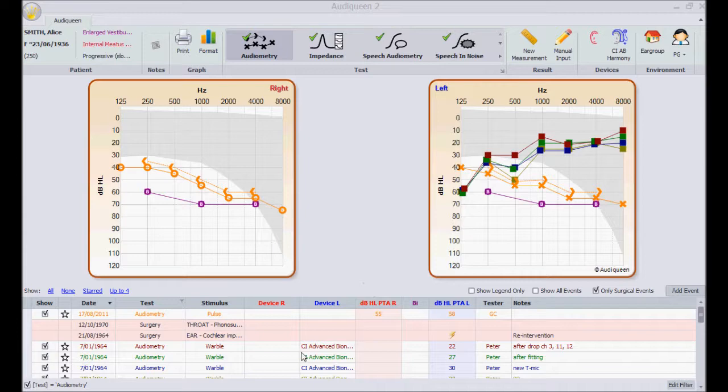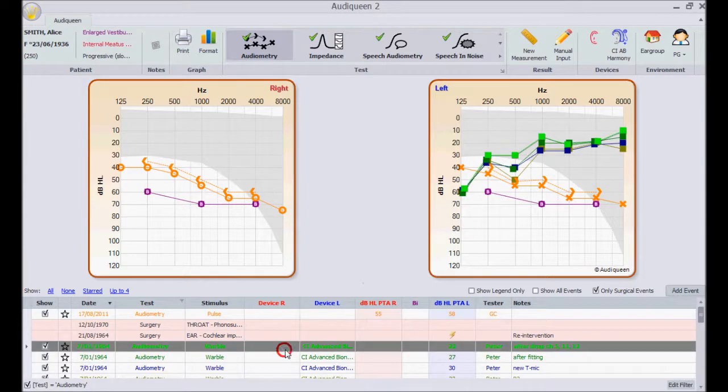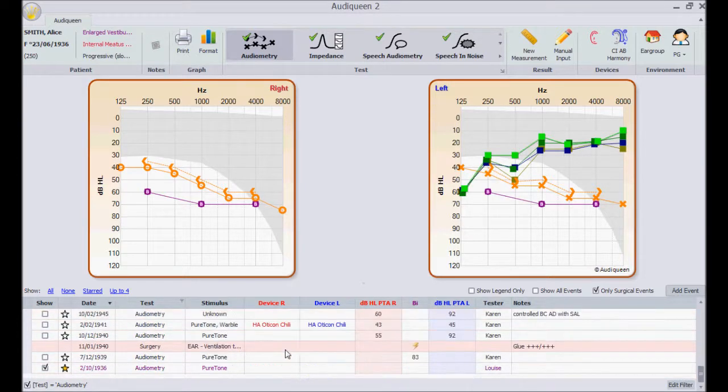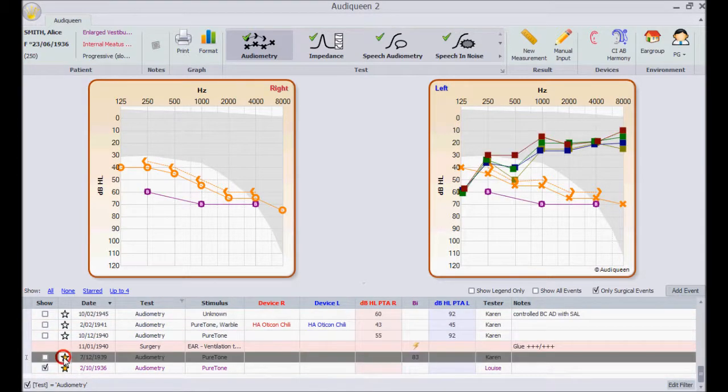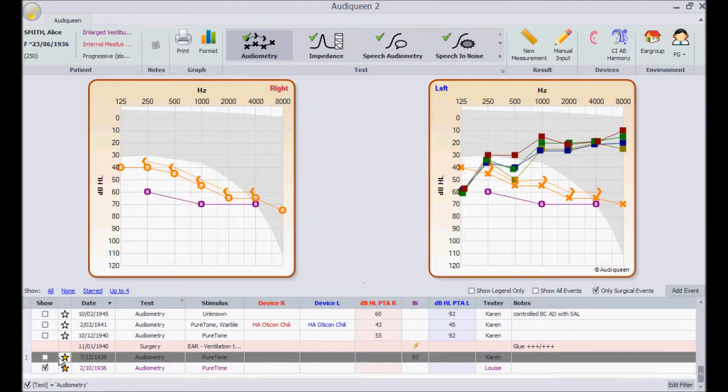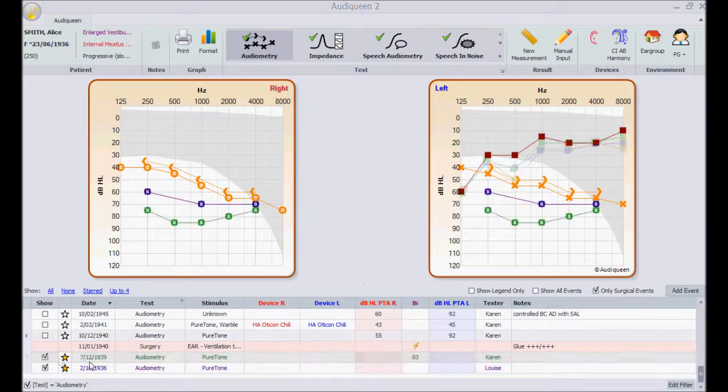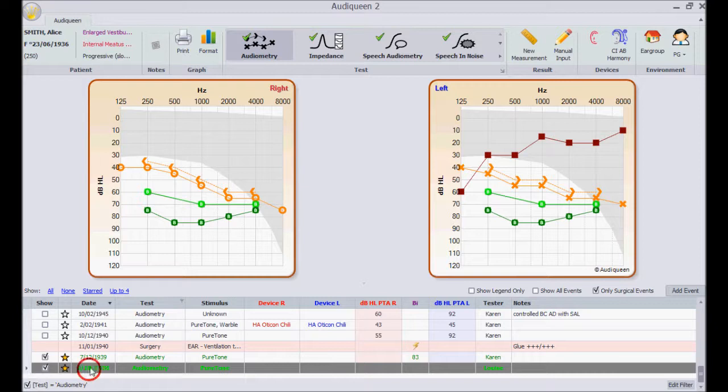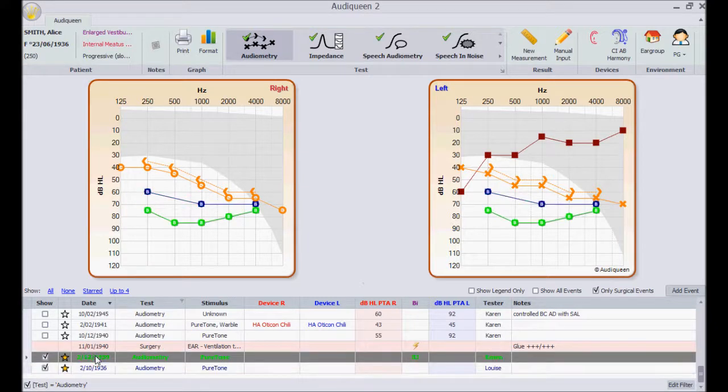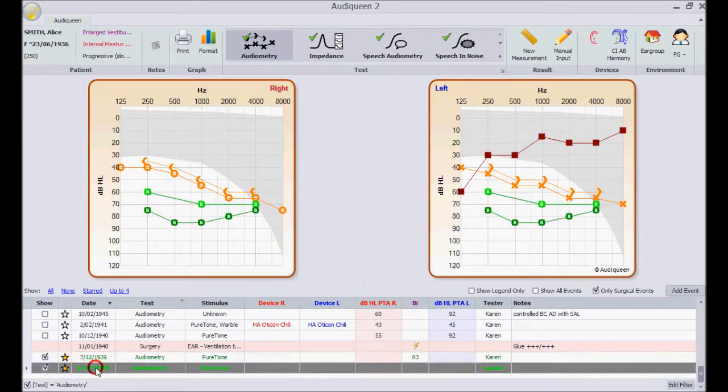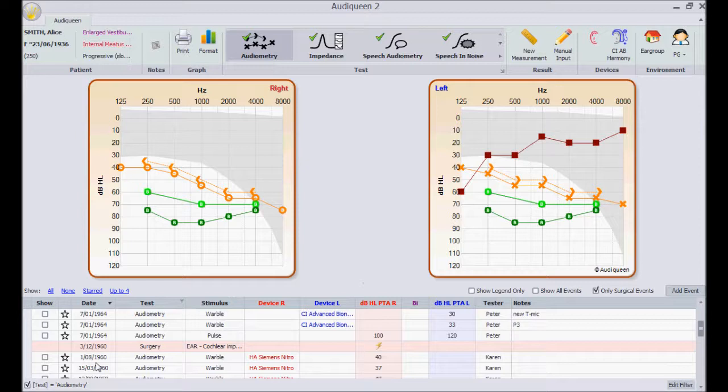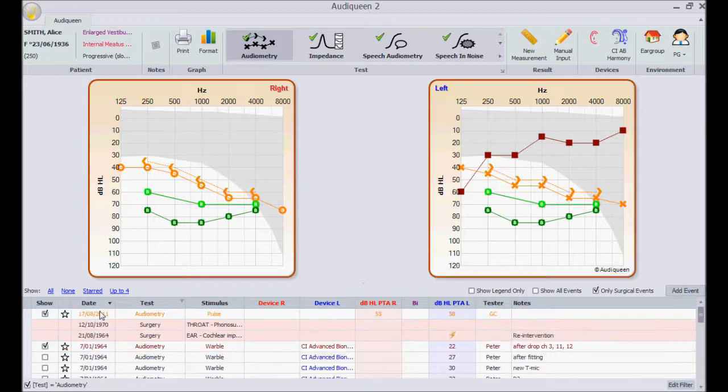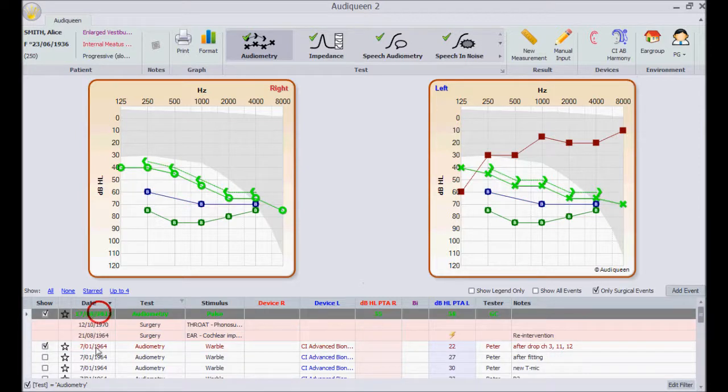Now I mark for instance two test results as my favorites. From now on, whenever I open Audi Queen, these favorites will be displayed, together with the two most recent ones, because I have chosen to have up to 4 results shown in one graph.